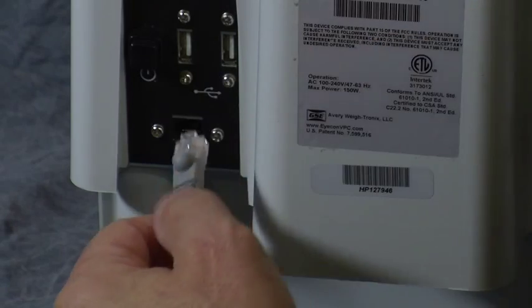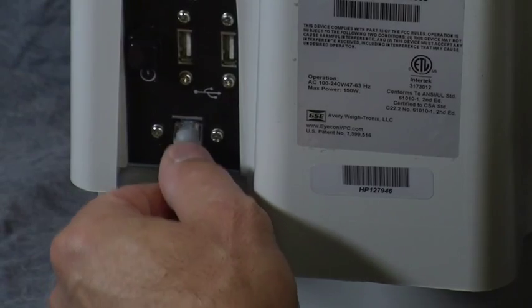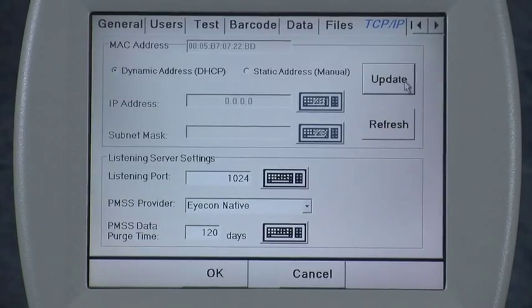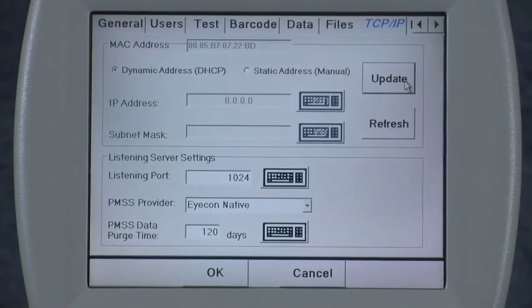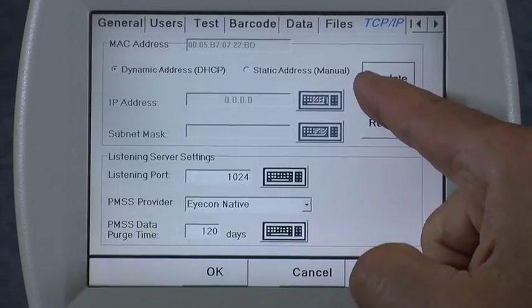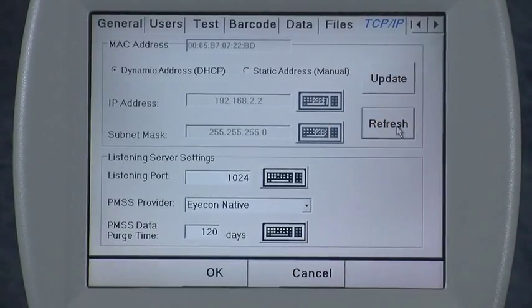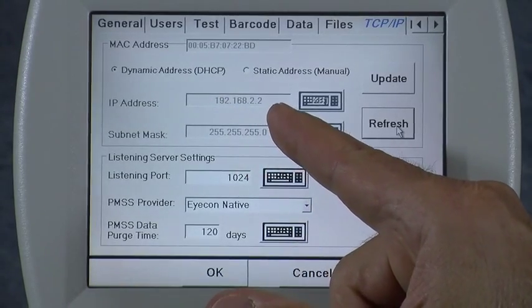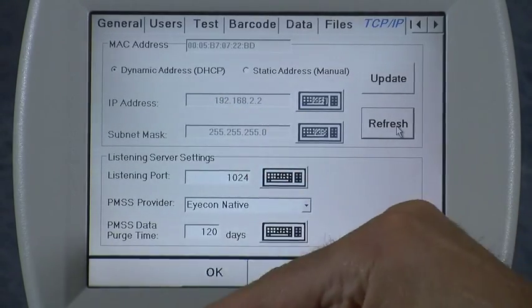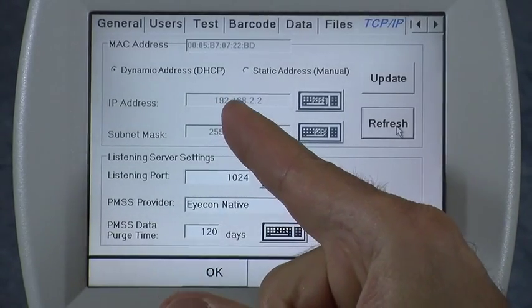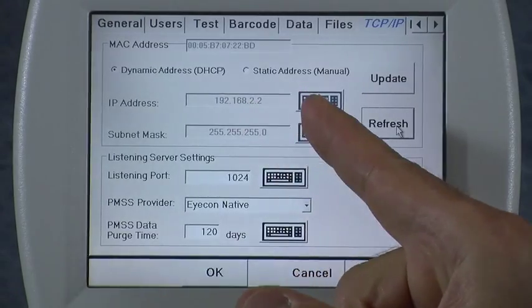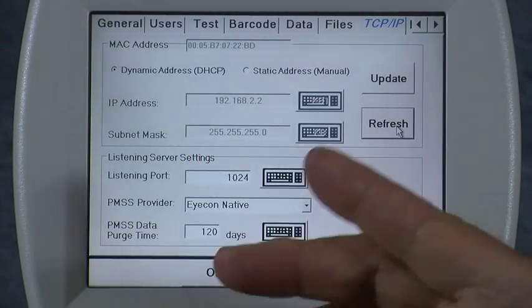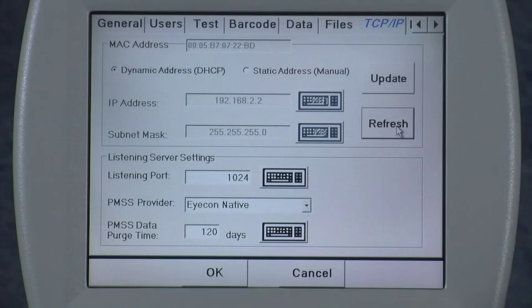I'm going to go ahead and make the connection now. After making the connection, wait a couple of seconds, then press Update and then Refresh. An IP address should appear in the IP address box — in this case 192.168.2.2. The subnet mask also shows up: 255.255.255.0.